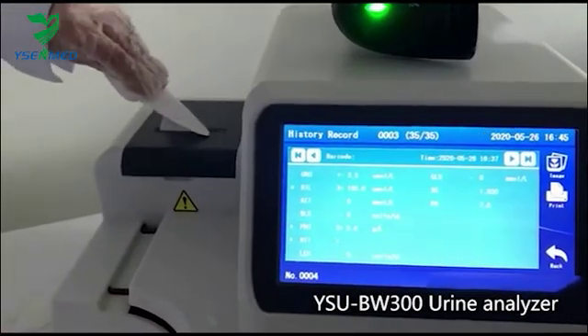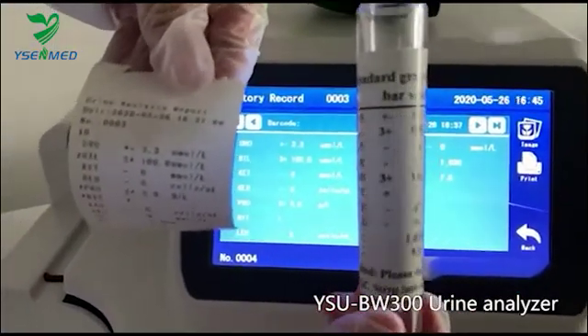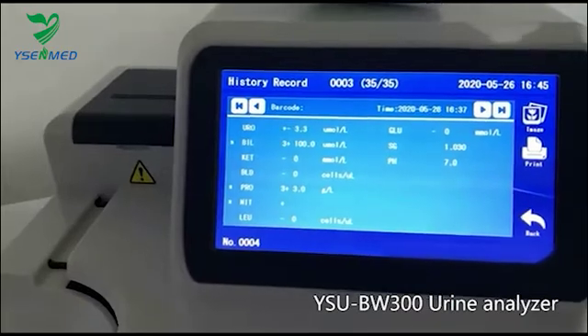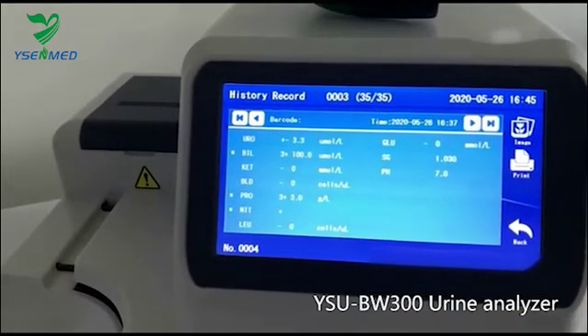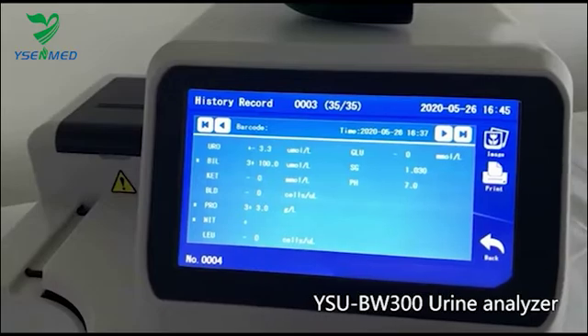If all parameters of results equal to the standard value, that means this machine is able to identify urine samples properly. If there is a significant distinction in comparison, please contact us directly.